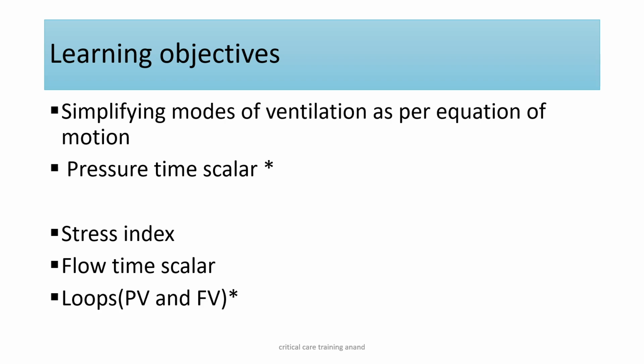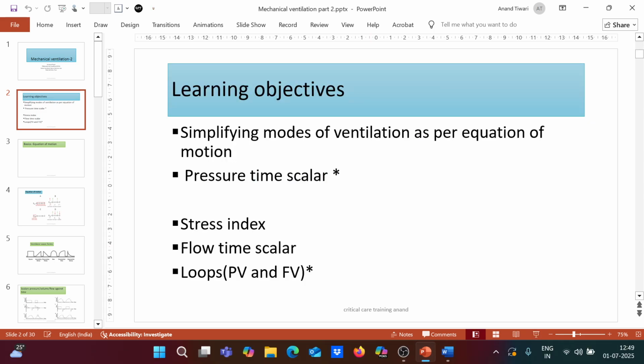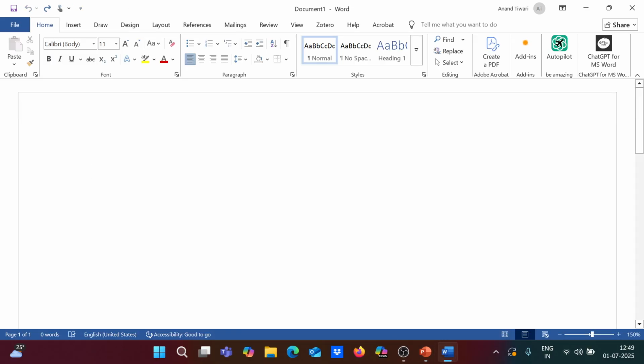So let's first understand what we discussed in the last session, the equation of motion, and how the control mode of variables can be depicted from it.